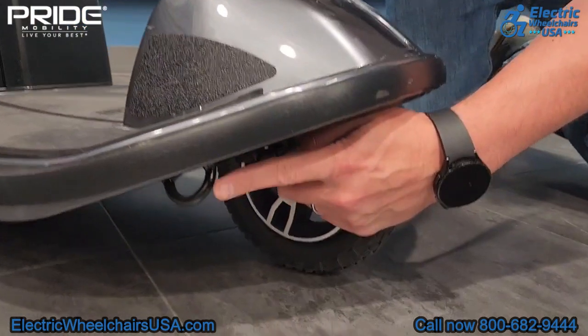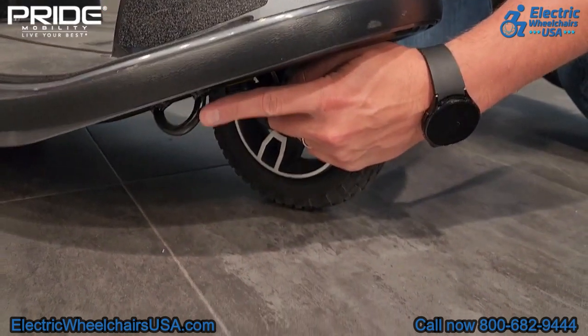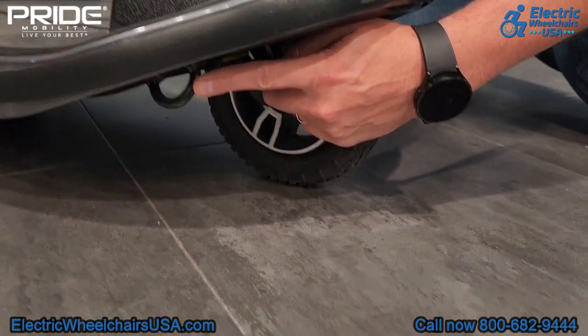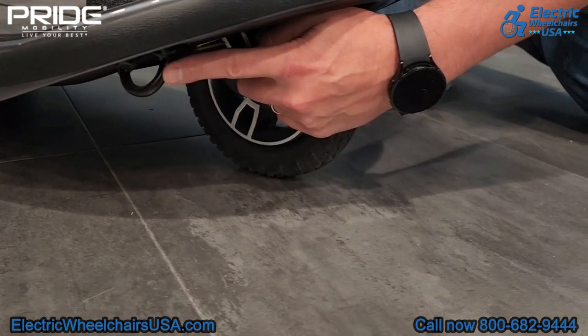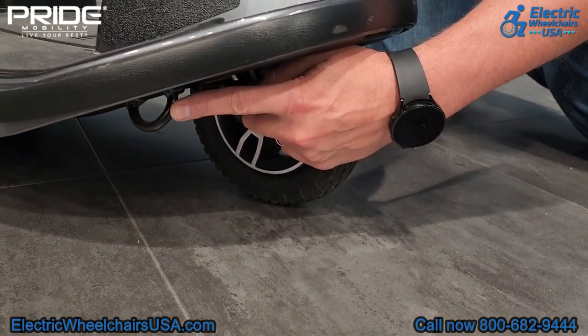Also on the front of the scooter, right by the front wheel, these are where your tie-down straps are. And there's 2 tie-down straps on the back as well. So that makes it easy to transport, but you can also break the scooter down for transport as well. So let's show you how to do that.